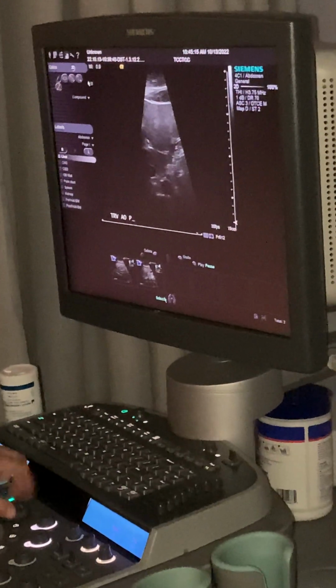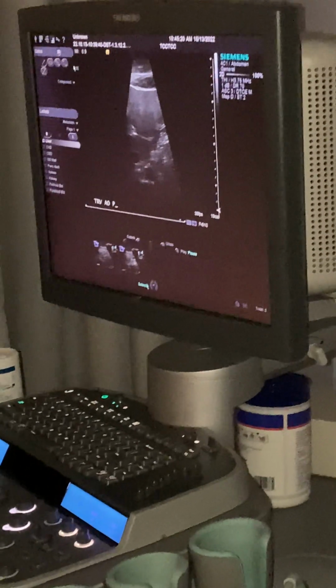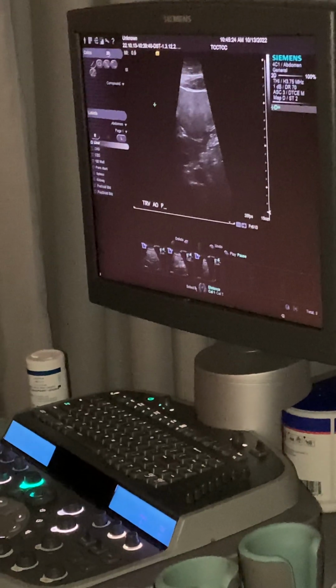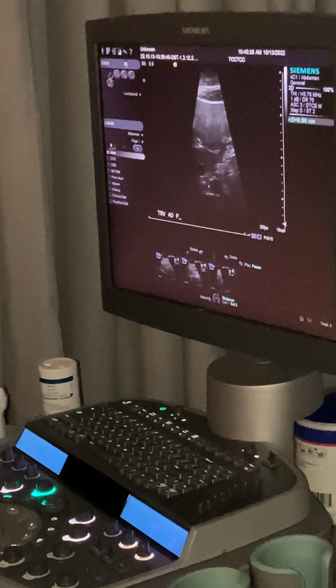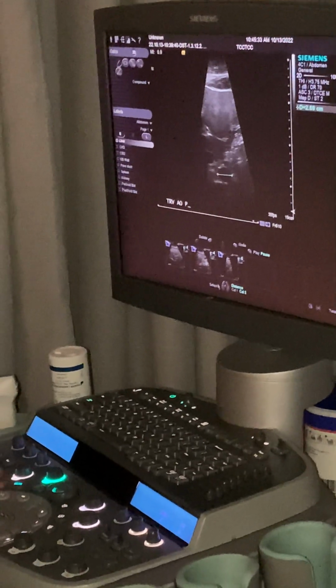So we're going to see our aorta. She's got pretty clean walls. They're not refracting out too bad. And so we could actually have a little bit better spot to put our calipers. But sometimes we just don't see those walls very well. Okay, so then our transverse AOP.